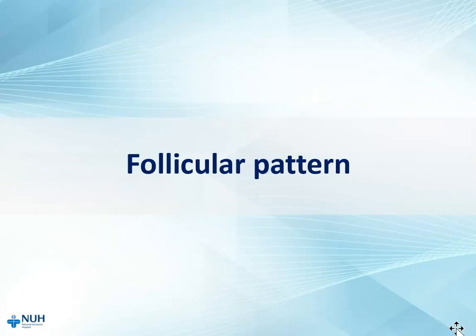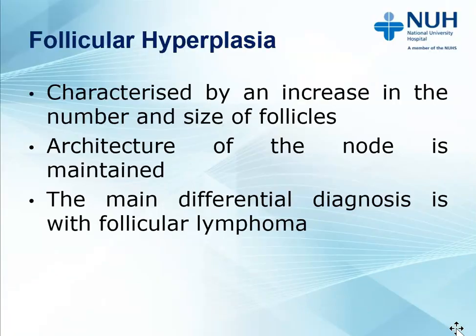First, let us consider reactive lymphadenopathies with a follicular pattern. Follicular hyperplasia is characterized by an increase in the number and size of lymphoid follicles. The node architecture is preserved, just that the follicles are larger and more numerous. The main differential diagnosis in this case is follicular lymphoma.